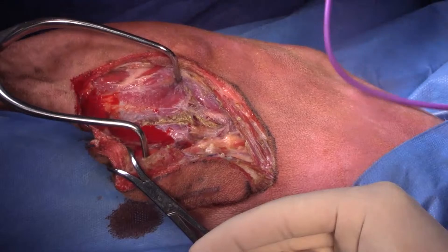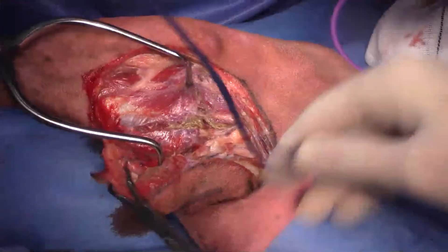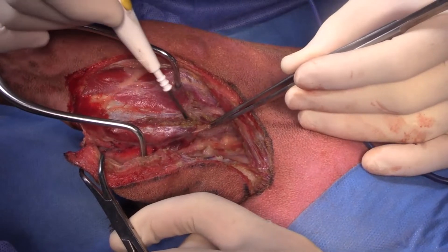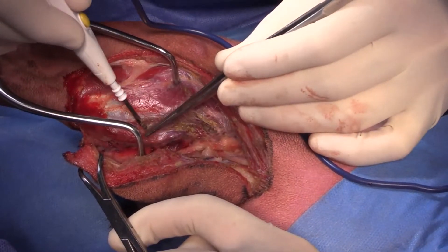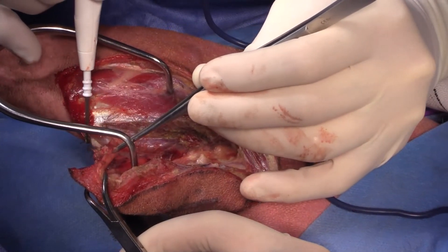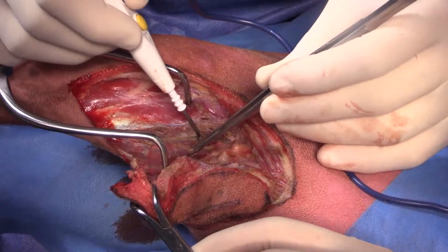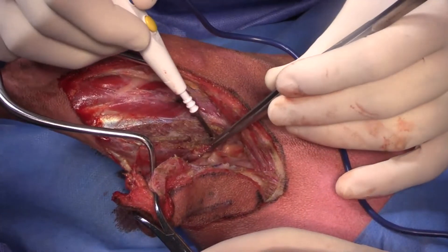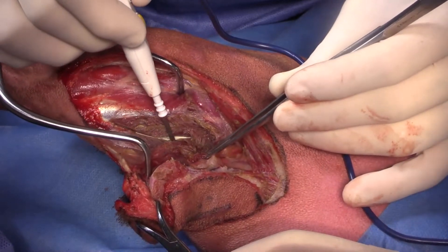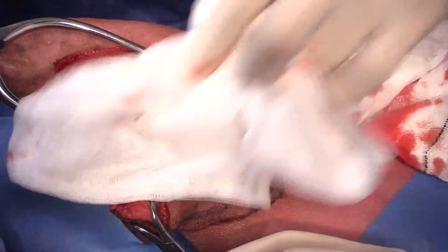There's a question about when you get down to the level of the muscles, do you change your cautery settings at all? I don't. It's a good question, but I do not change the cautery settings when I get down to muscle. If I'm getting a lot of twitching, you might lower your settings a little bit. I am trying to get a little bit of a margin around the tumor that's visible.